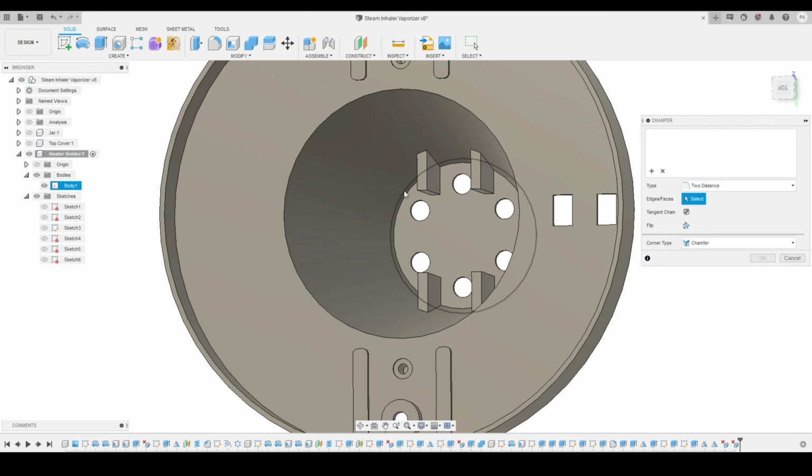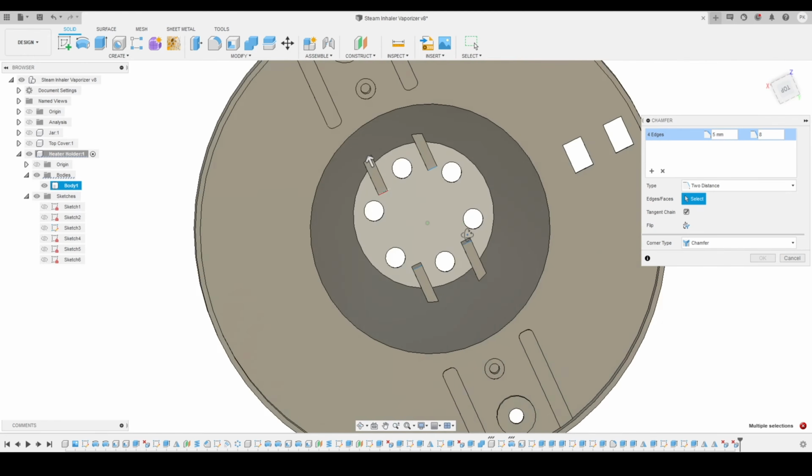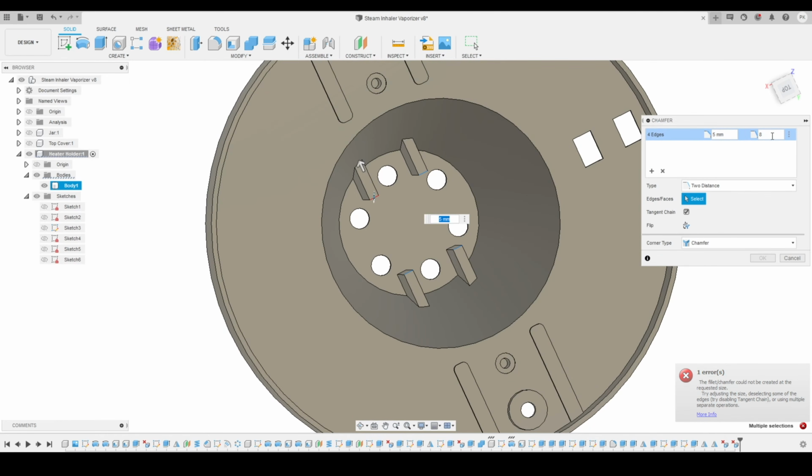So we'll just apply a 2 distance chamfer with a distance of 8 millimeter on one side and 5 millimeter on the other side. So it is just quick since we had already done this earlier. So we had just provided that. I think I had to change the 8 must be in the 5 millimeter place, and 5 must be in the 8 millimeter place. So I'm just going to change both of them, and press OK.